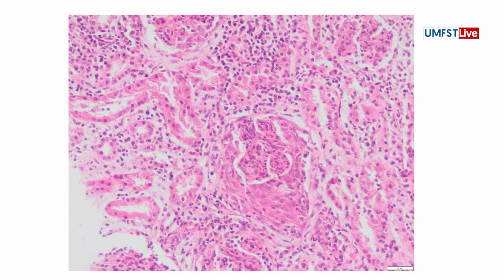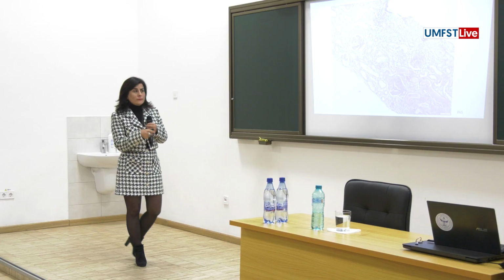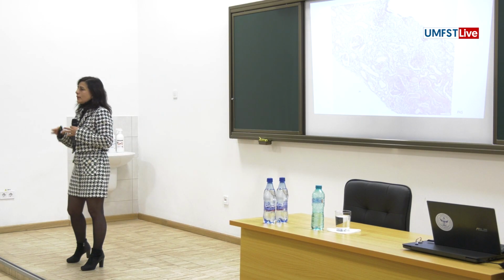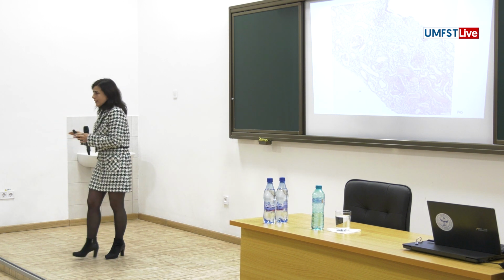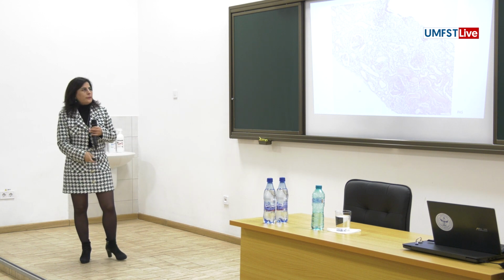It's telling me what the pattern is. I don't have to just make a diagnosis; the biopsy is telling me. The crescents, cellular crescents. At this point, when I saw the H&E, I called my colleague. This is a necrotizing crescentic glomerulonephritis. You can do what you want to do, but I will diagnose it later.